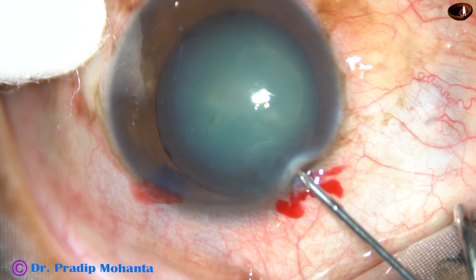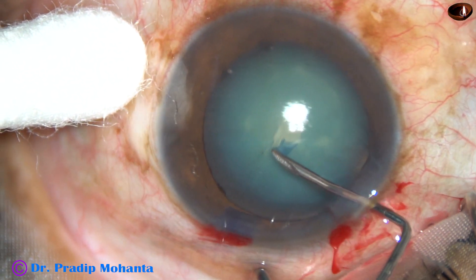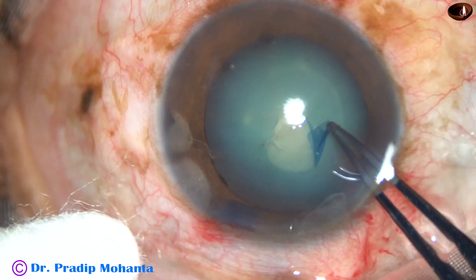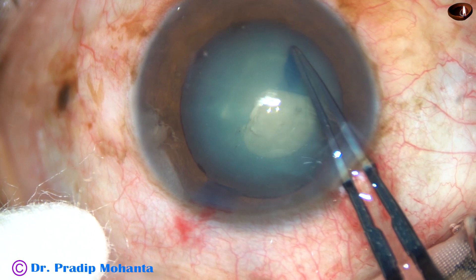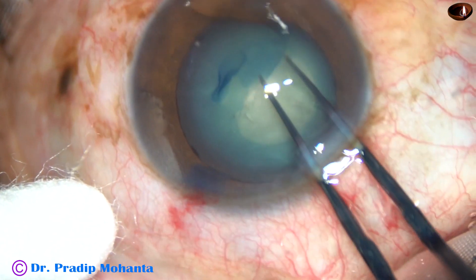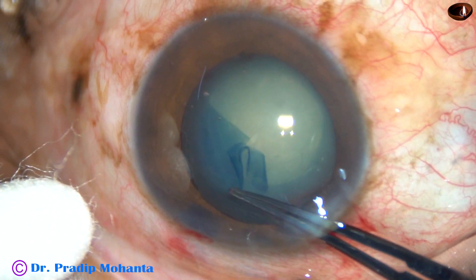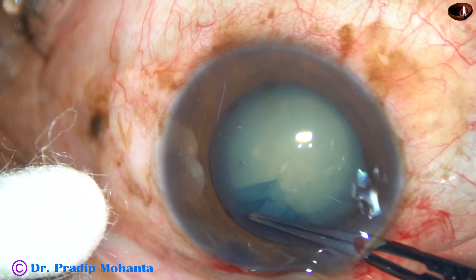Yes, the pupil has dilated a little more because of HPMC. And now I am going to do capsulorhexis. The anterior capsule is incised. A tag is raised. Now I use Utrata forceps — hold this tag. All the time, just lift the anterior lip of the main incision to prevent leakage of viscoelastic substance. This is a non-mature cataract, so we can do the rhexis in one go.